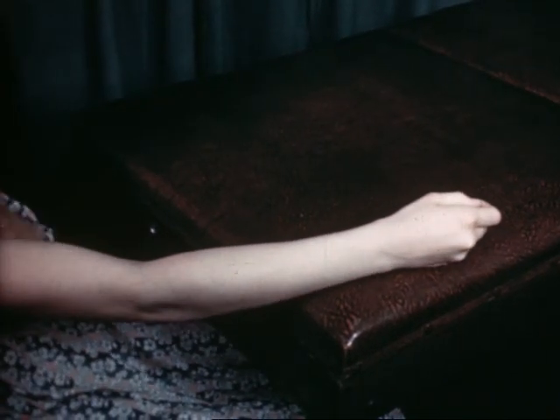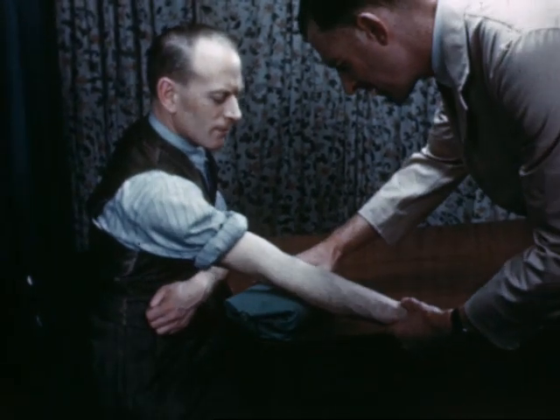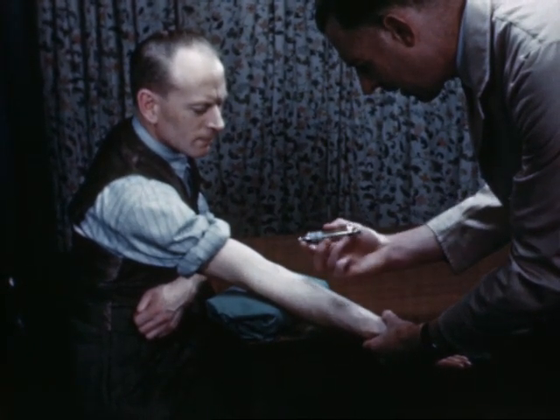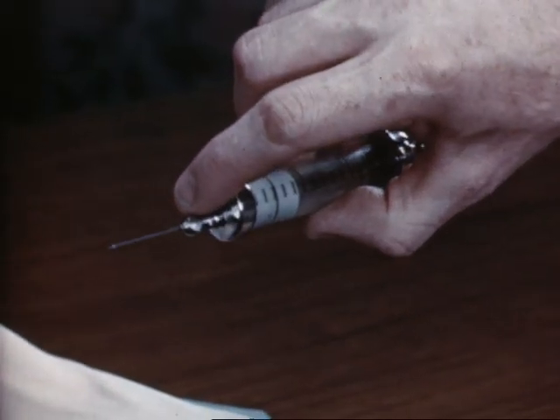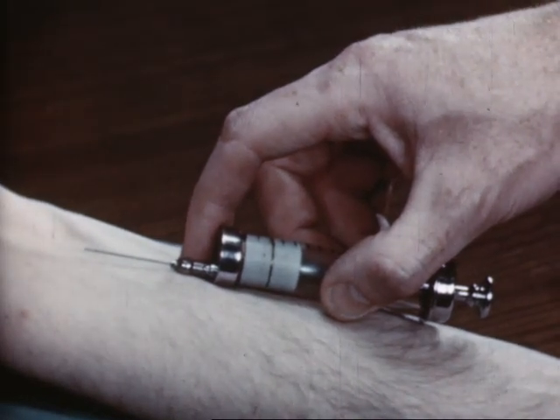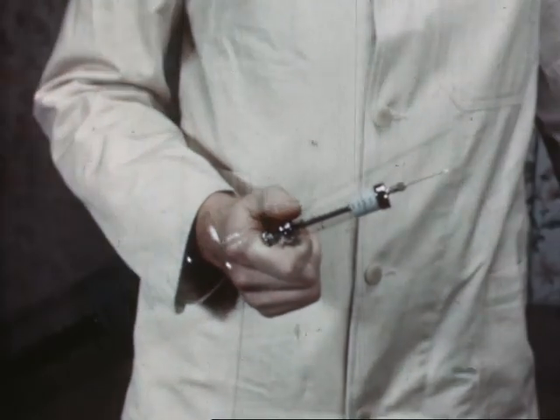Many a vein is missed by not having the arm fully extended or by the patient drawing away. See that the patient is comfortable and extend the arm fully, supporting the elbow on a pad or pillow if necessary. It's important to hold the syringe correctly — never have your fingers underneath it. Leave a window so that you can see the graduations. Keep your thumb and fingers along the sides so the syringe lies nice and flat on the arm. If you have a central syringe service, you can insist on airtight syringes and sharp needles supplied already assembled and sterilised.